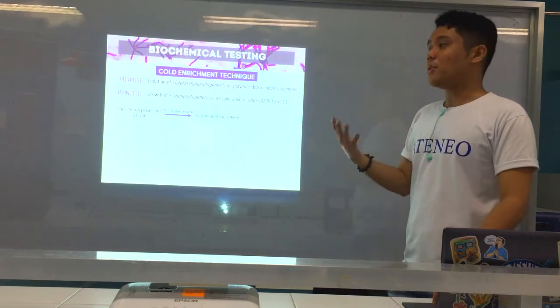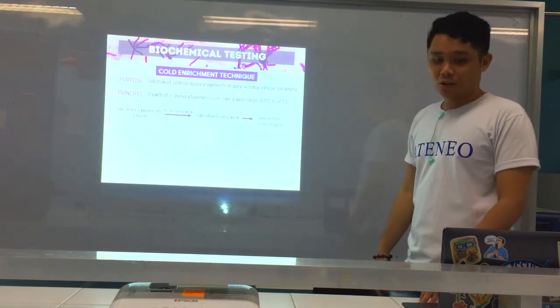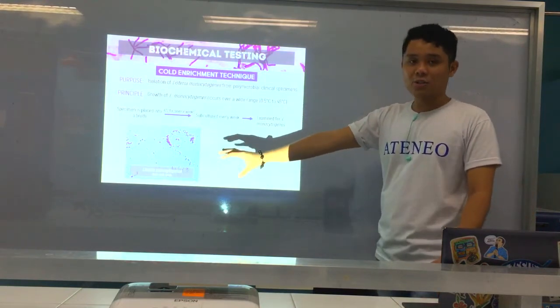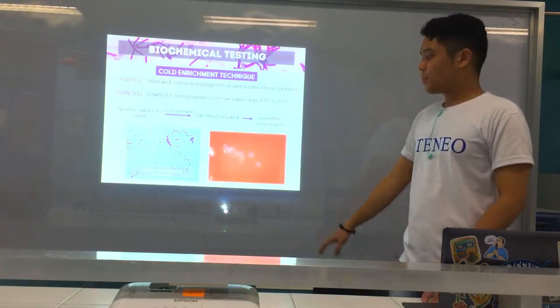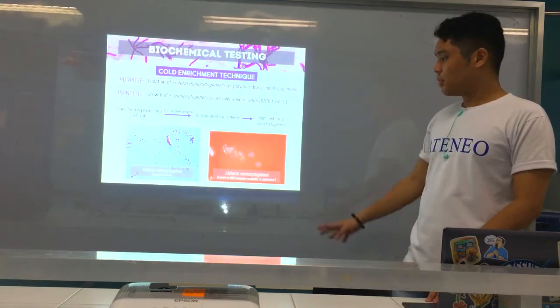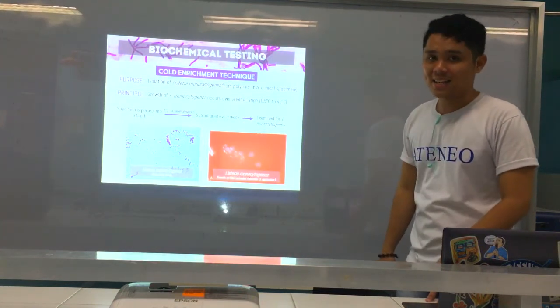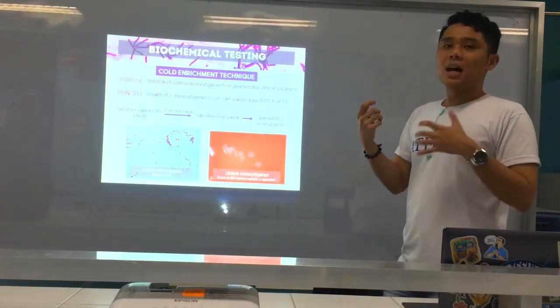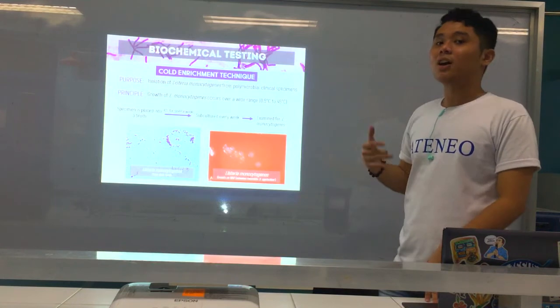You subculture every week, and then we examine for L. monocytogenes. It's either we perform gram staining, for example, with L. monocytogenes as the result, or we inoculate it onto BAP. On BAP, it resembles the growth of S. agalactiae. Or again, you can always perform motility, umbrella pattern, other tests, esculin hydrolysis, or CAMP test.